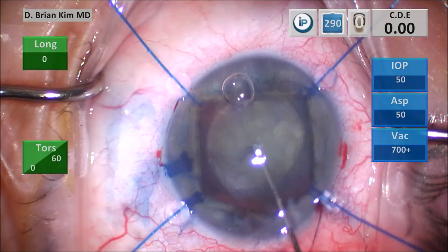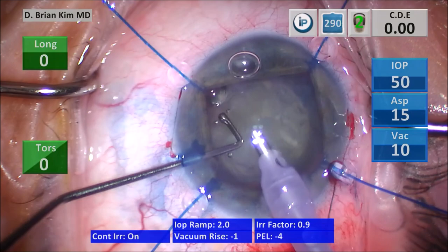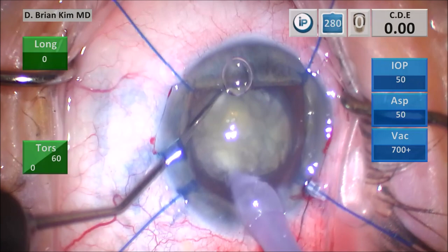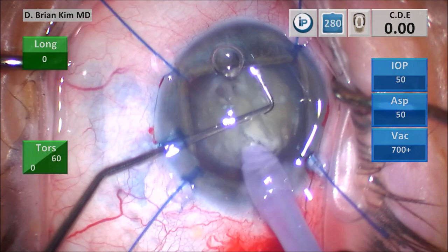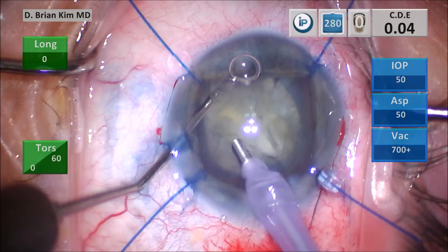I switch to the phaco, lift the incision with irrigation off to minimize Descemet's trauma, and remove the surface epinuclear material. This creates an epinuclear ridge — my landmark to go under, out into the capsular fornix and equator, then turn the phaco tip vertically sub-incisionally to crush the lens completely in half. This is a double chop. I place the chopper out to the contralateral equator, pull it towards the phaco tip centrally — that's the cross-chop maneuver. I keep the chopper at the equator and crush it against the phaco tip to remove the first quadrant.